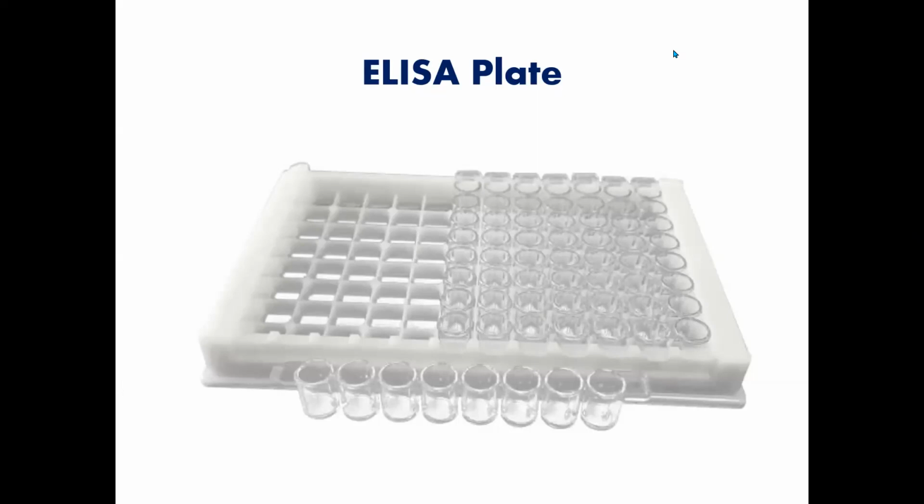Are the antibodies on lateral flow assays IgG or IgM? You can choose either. It depends on what you want to find. But IgG tends to be more specific than IgM. So if you're looking for an antigen, it would be more likely to use IgG. Without washing, the accuracy of the test, I think this is a response.